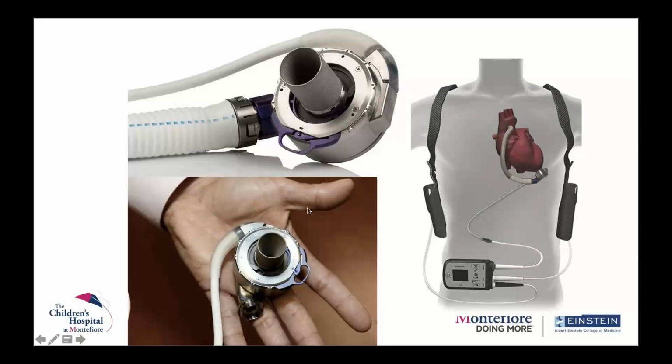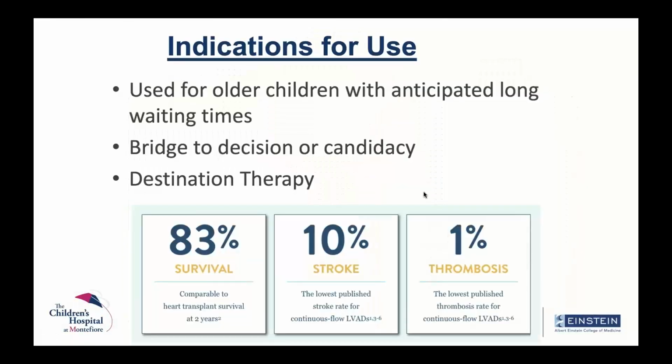And it is then connected to the batteries on the side, or it can also be connected to a socket. And it is used in older children with long anticipated waiting times. It can also be, again, used as bridge to decision, and it can be used as destination therapy.